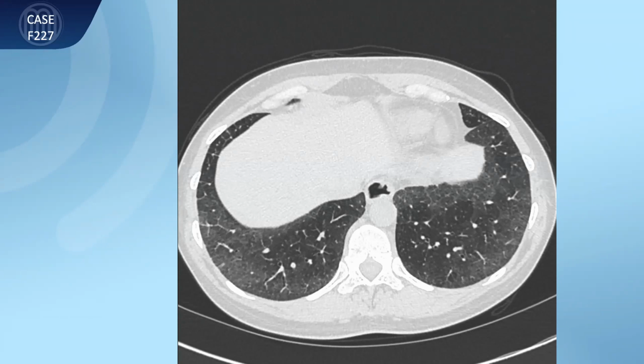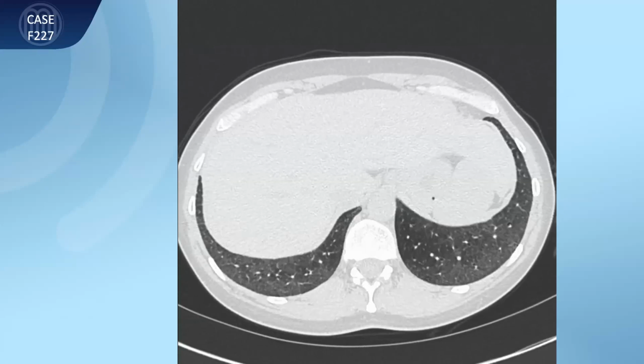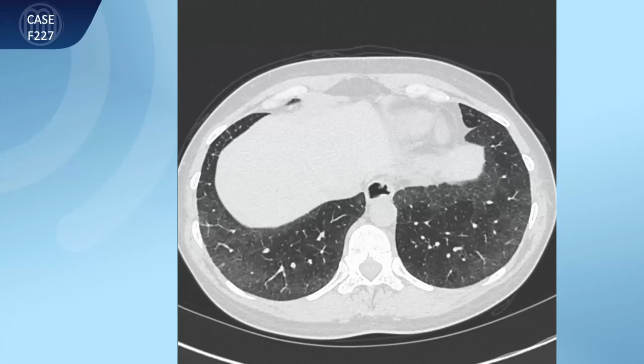How much reversibility is there? I don't know. I always get this question from my pulmonologist: is this a reversible process? Yes or no? And honestly, in most cases, this is not reversible.